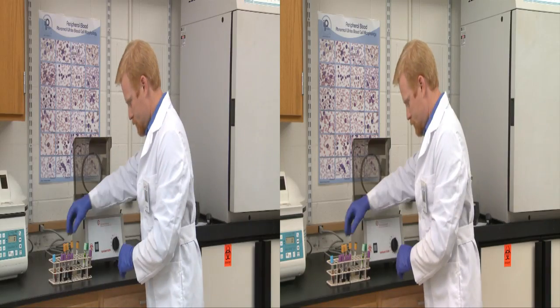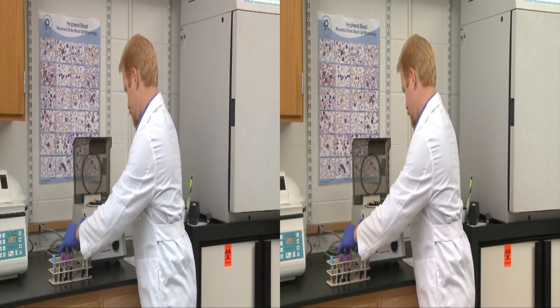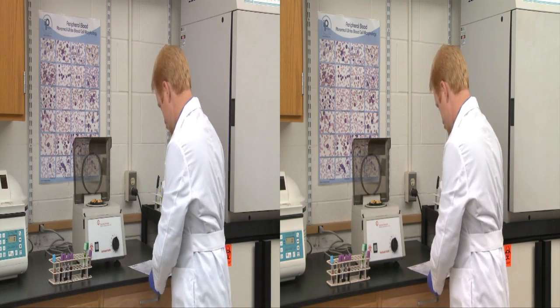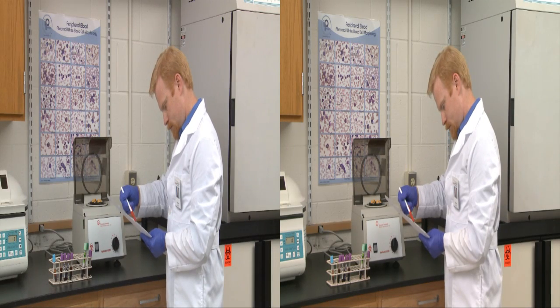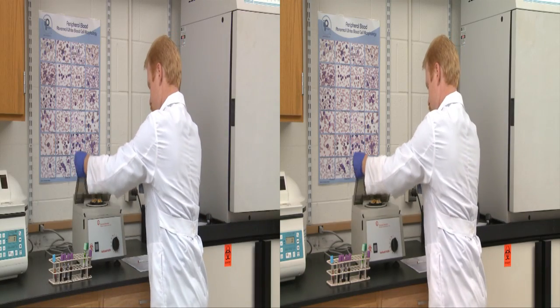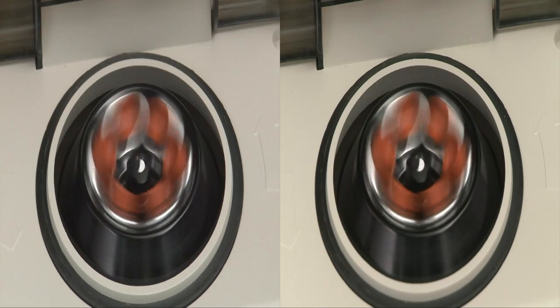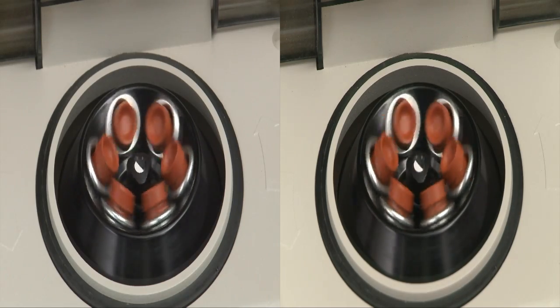Fortunately, most blood draws are completed in an entirely professional, skilled, and successful manner. Most, but not all. Poor technique, poor judgment, lack of knowledge, loss of concentration, and undue haste are all factors that can negatively impact the integrity of a sample. Or worse, that can create undue stress and pain for the patient or cause a patient physical harm. Let's take a look.